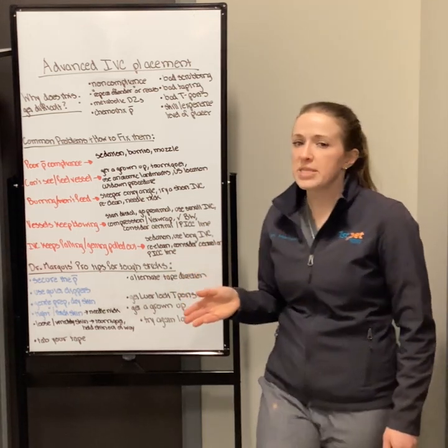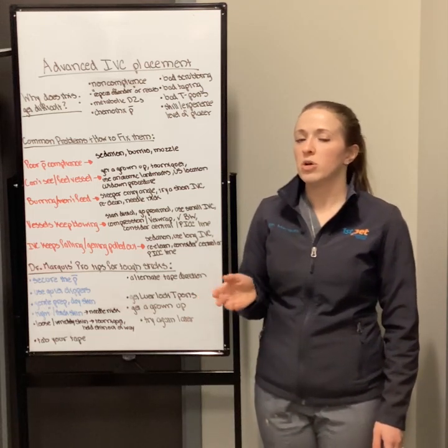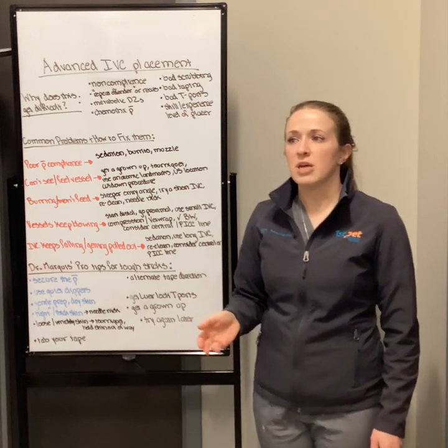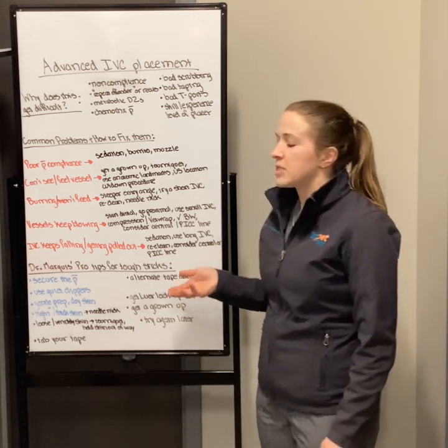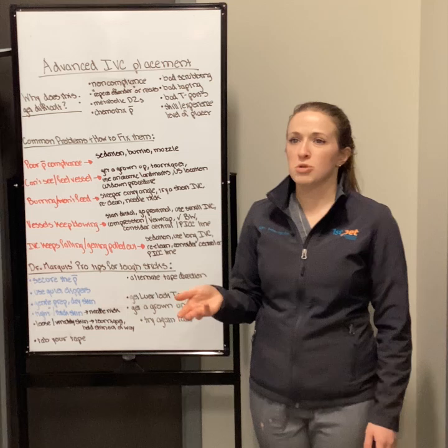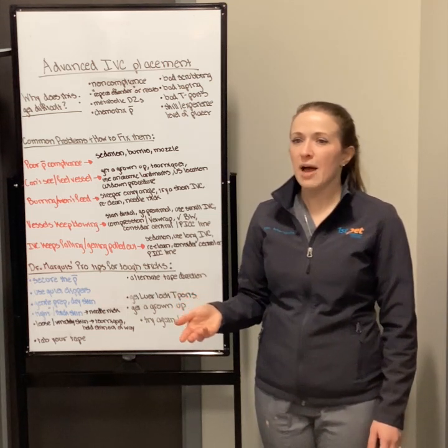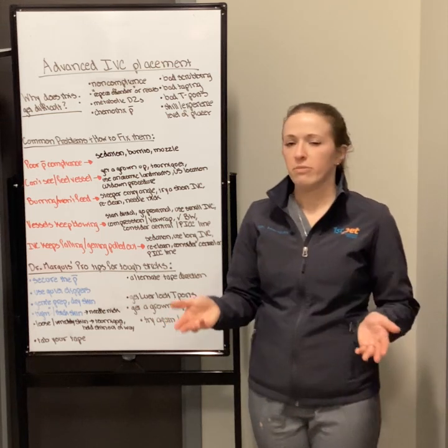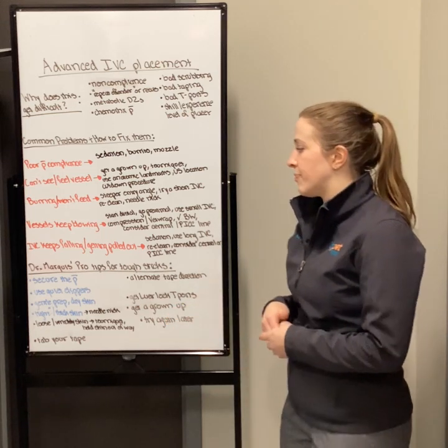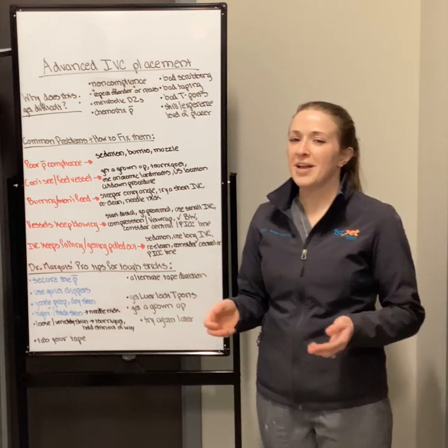Again, consider placing a PICC or a central line. Obviously this might be for patients that are more debilitated, where you need to give more medications, fluid treatments, things like that. But if you have a situation where the vessels just aren't holding up very well and catheters keep getting ripped out, place a jug cath, place an e-collar on that animal, give it some trazodone, and be on your merry way.